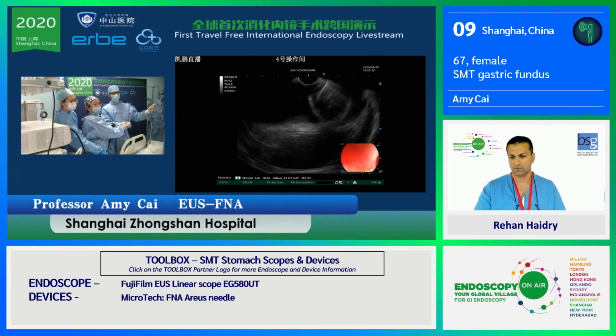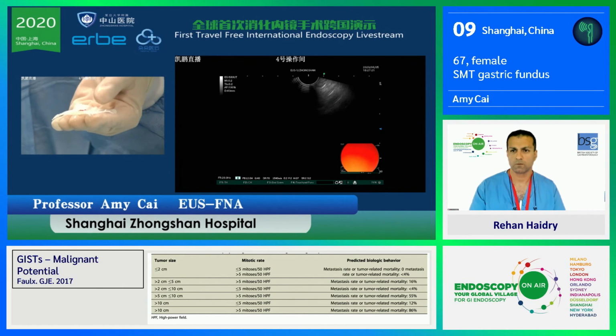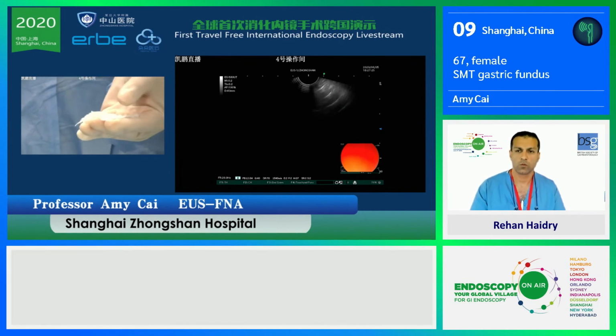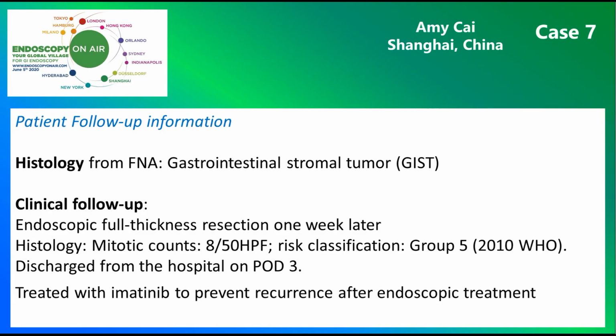So I'm going quick poke and then slowly withdraw. Okay. We will see the mitotic status in the histology result, and then decide whether it's suitable for endoscopic resection.